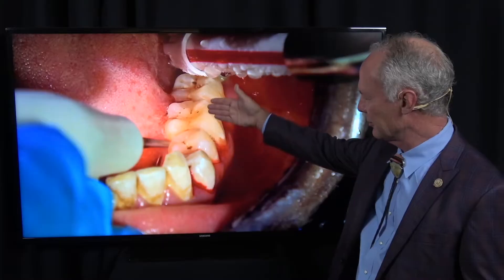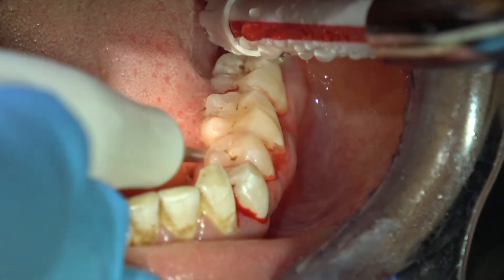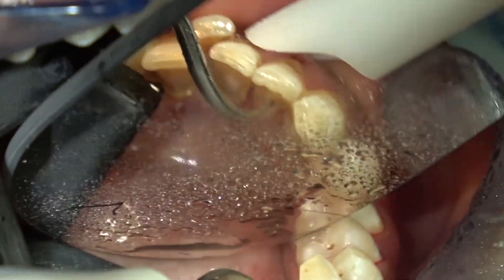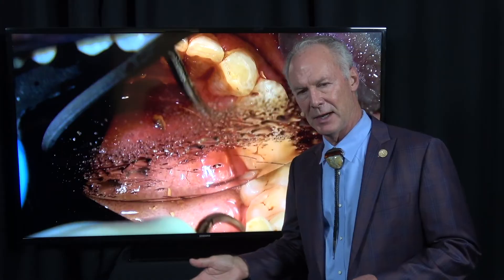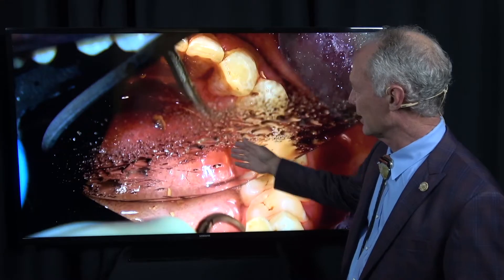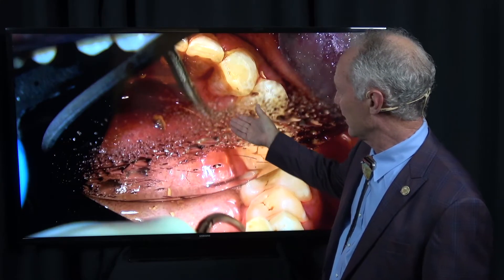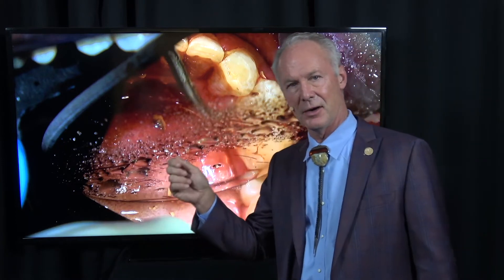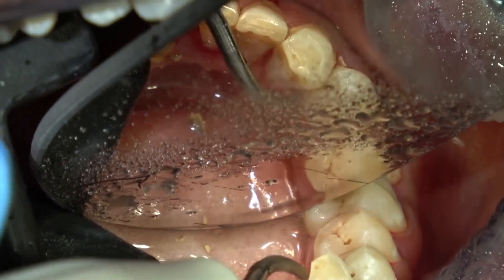I'm just feeling the interproximal surfaces of those teeth from both the facial and the lingual or palatal. You can see how the calculus is breaking off in chunks from the mandibular anterior — I'm removing the calculus, plaque, and stain with the tip of the ultrasonic instrument. Someone once commented that in dental school they were instructed not to let the tip of the ultrasonic touch the tooth surface. I don't know how you could possibly remove calculus, plaque, and stain without the ultrasonic touching the tooth surface. You're not bearing down hard, but it must touch the tooth surface.